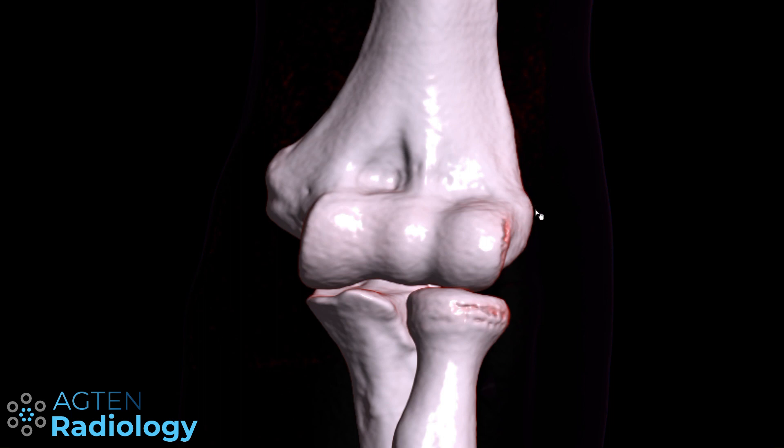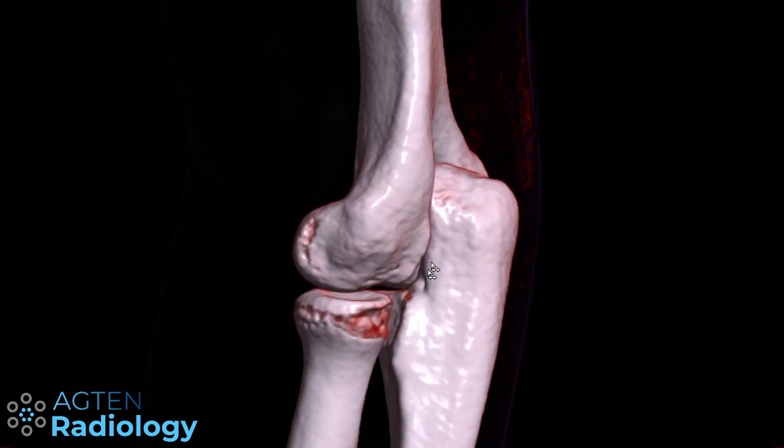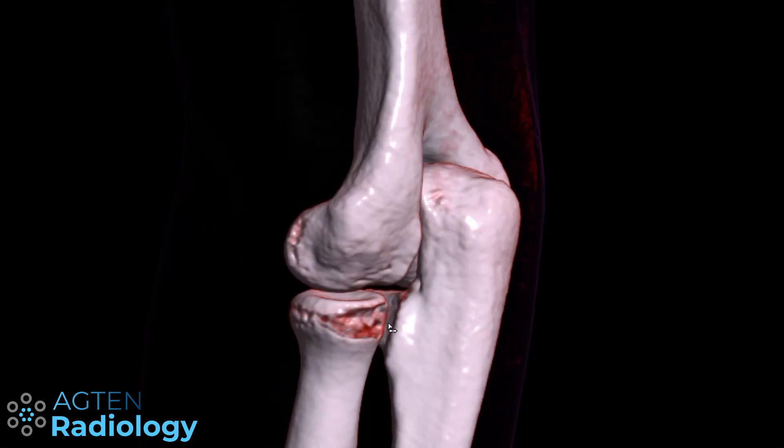Here it is important to remember that we have this flat area here and then this ramp down to the capitellum. We will come back to that later in the MR images. Now turning to the lateral view, this is a view onto the lateral epicondyle, and then we have the radial notch where the radial head lies in.